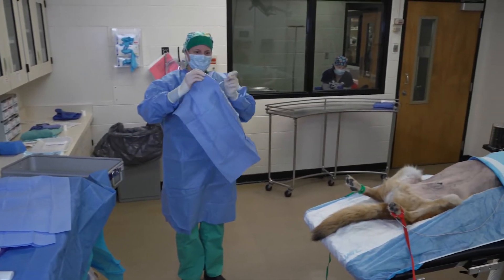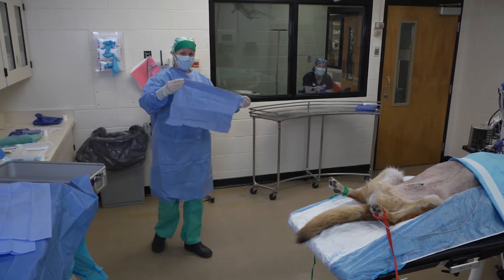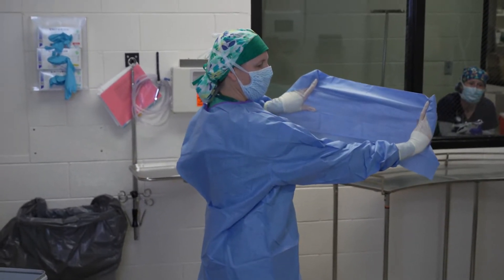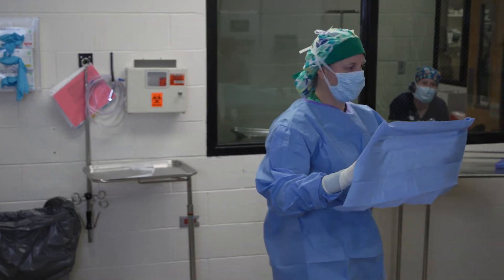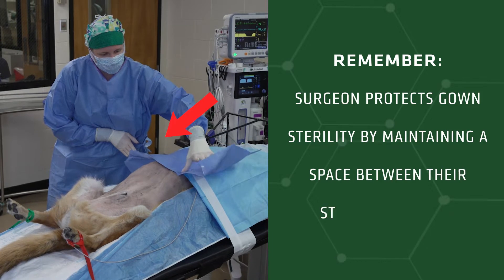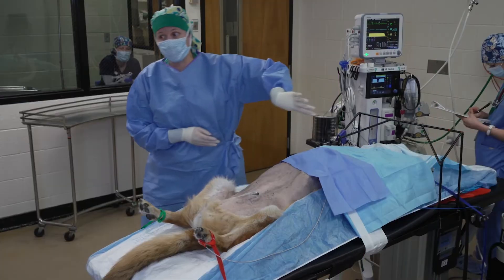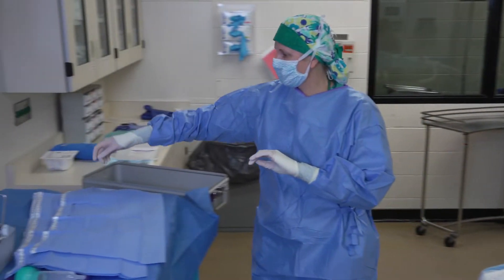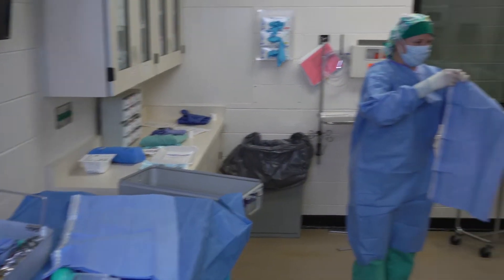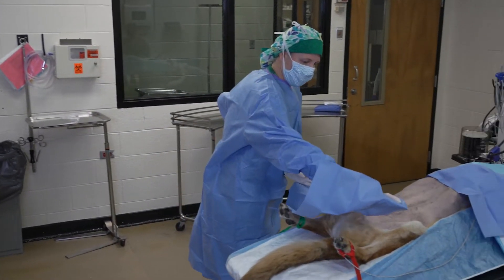I'm going to take my first drape, pull the adhesive protective sheath off, and drop that. I'm now going to wrap my fingers around so they're protected in the drape, so that when I lay this drape on the patient I'm not going to contaminate my glove. I'm going to put my first drape on cranially and touch that drape down. It's okay to shift the drape a little bit away from the sterile field, but I never want to go towards it.